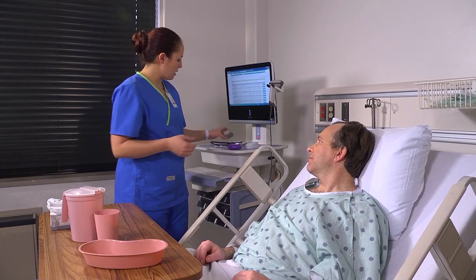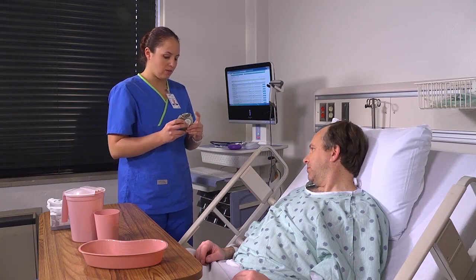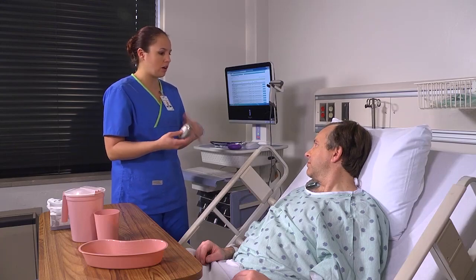Okay, the dry powder inhaler, they just load 1 dose at a time, okay? You slide it down like this, and then you have this trigger that actually releases the medicine. Discuss with your patient why the medication is being given and explain how a DPI works. Explain that you will use a training device to teach him how to safely use the device.